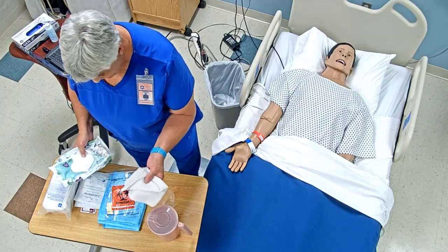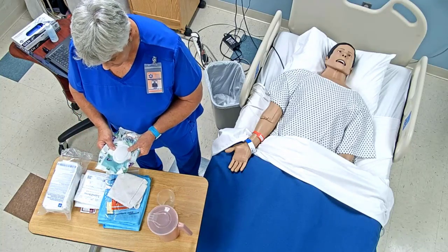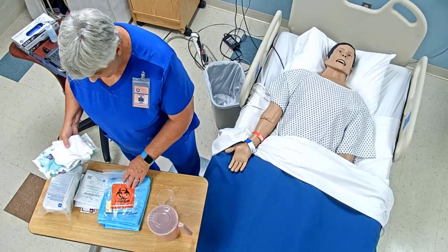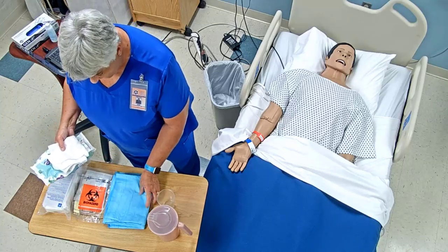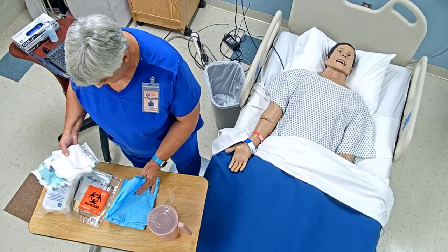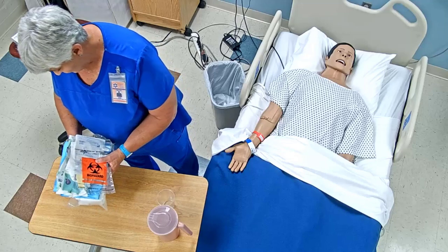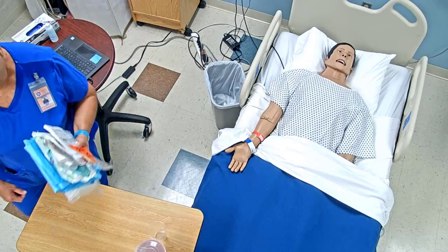I also have a washcloth to do pericare, and the supplies that the hospital provides. Usually these are kept in a warmer, so it's nice for the patient. I have my biohazard bag to go along with my specimen. And then I've got my blue pad, a couple of them here underneath, absorbent pads to use with the patient. So once I've identified I've got everything I need, everything's intact, and everything I need is sterile, then I'm going to go ahead and go to the patient's room.